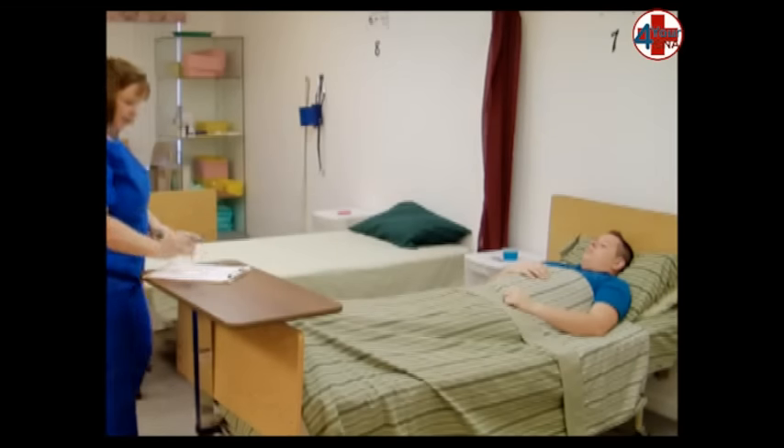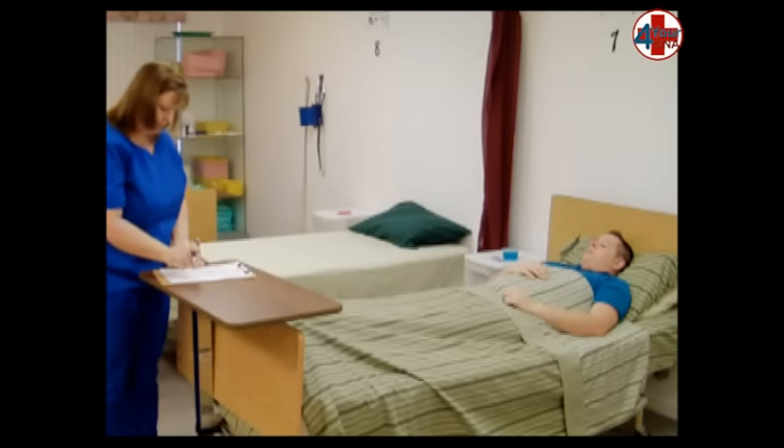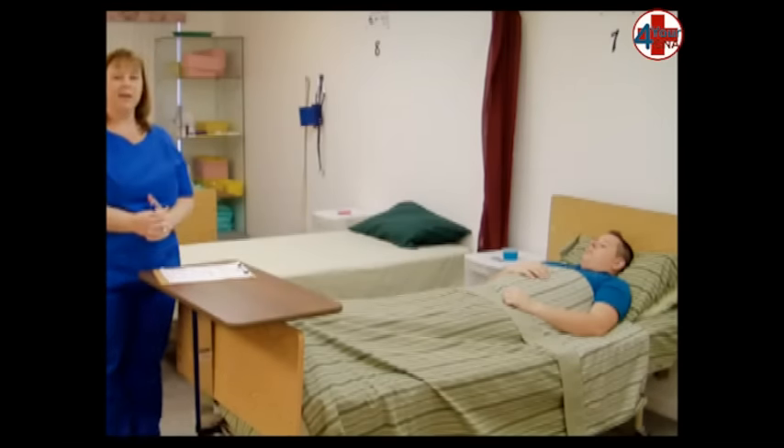When you return, document the patient's blood pressure on the documentation sheet by writing the larger number, followed by a diagonal line, and then the smaller number on the space provided for blood pressure. Review the steps of your skill and tell the evaluator, 'My skill is done.'